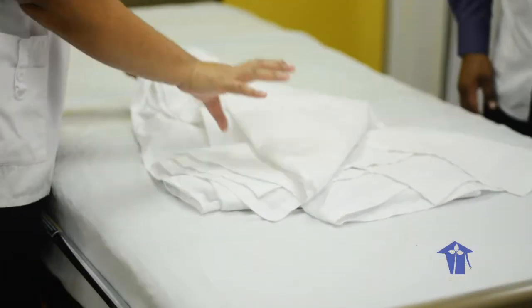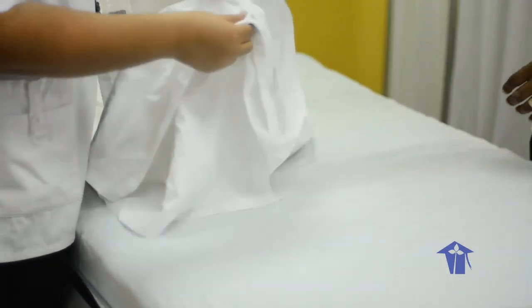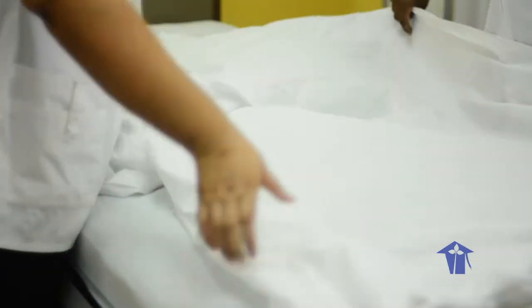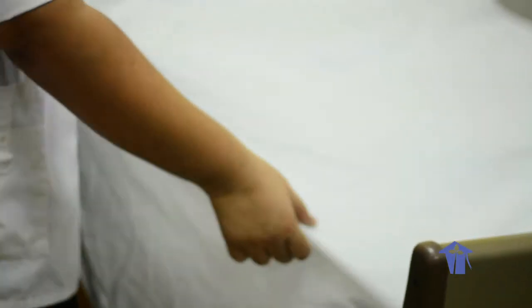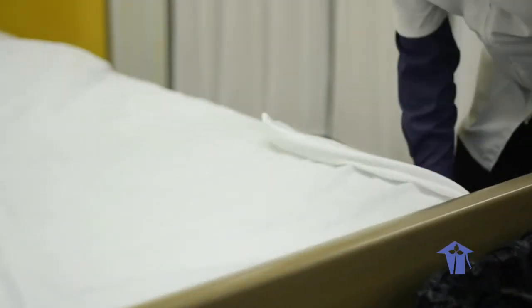We're going to put the first sheet, the top sheet. If you need to put an Inco sheet because you know a patient is coming in, you will do that now. Just place your Inco sheet there. Top sheet is the same thing. You're going to raise. The mitre. So on my side, Mr. Karim is going to mitre and tuck in his side, because my side is where the patient is going to come in from.